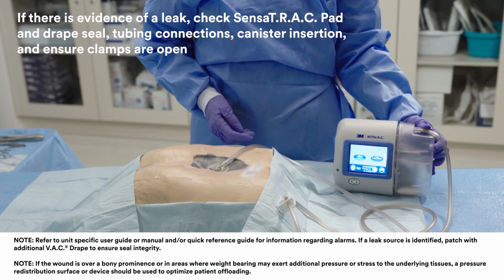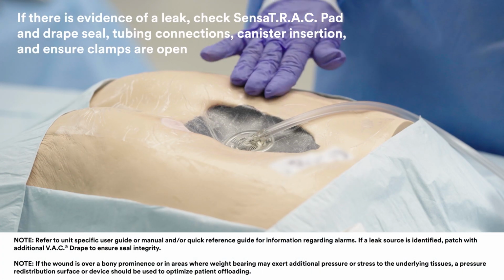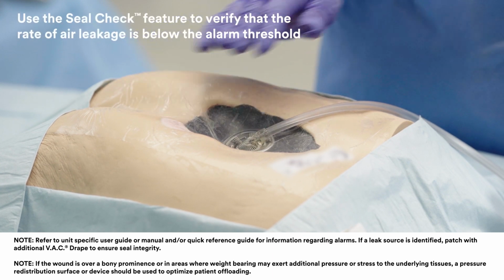Assess dressing to ensure seal integrity. The dressing should be collapsed and have a wrinkled appearance. There should be no hissing sounds.